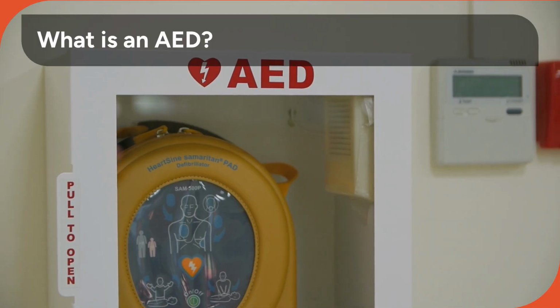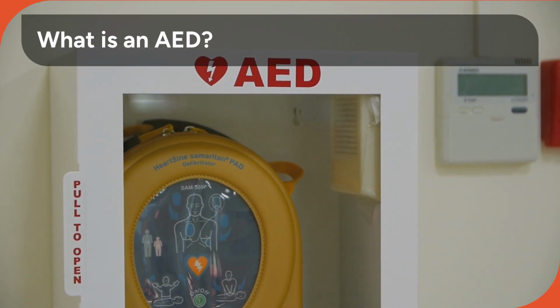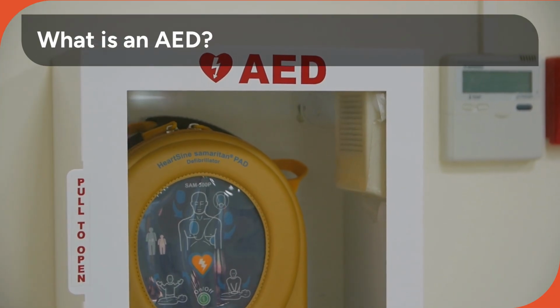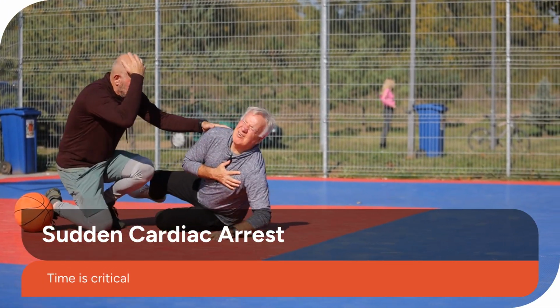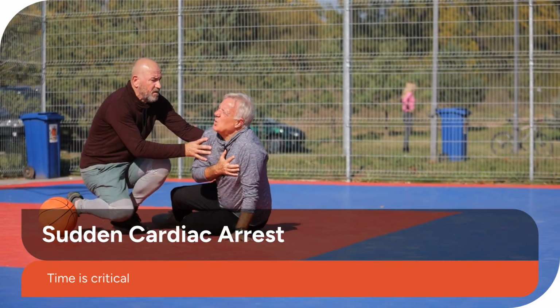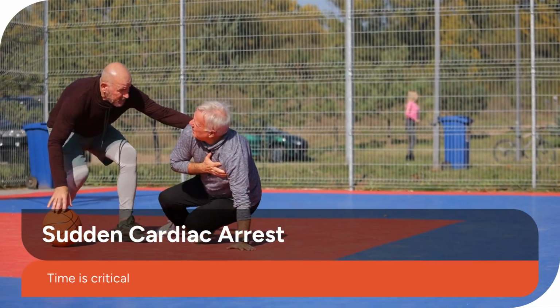An AED is a portable, easy-to-use medical device that automatically diagnoses life-threatening heart rhythms and is capable of treating them through defibrillation, which is the application of electricity that stops the arrhythmia. Sudden cardiac arrest, or SCA, occurs when the heart suddenly and unexpectedly stops beating effectively, often due to an electrical problem. Survival rates drop dramatically for every minute defibrillation is delayed.